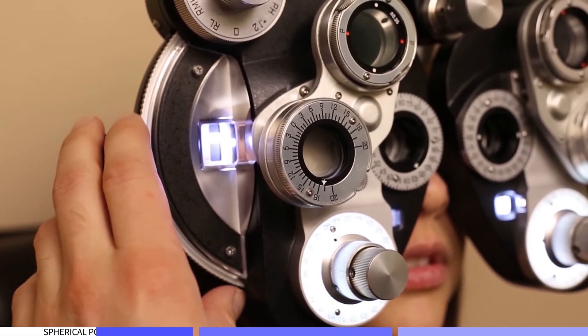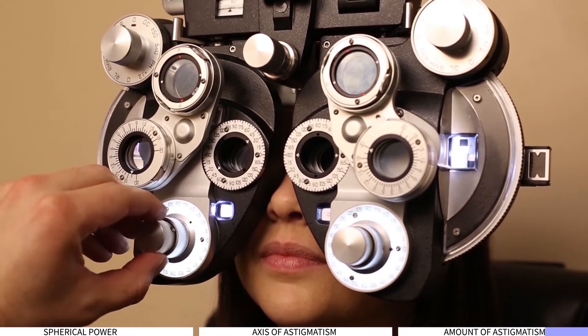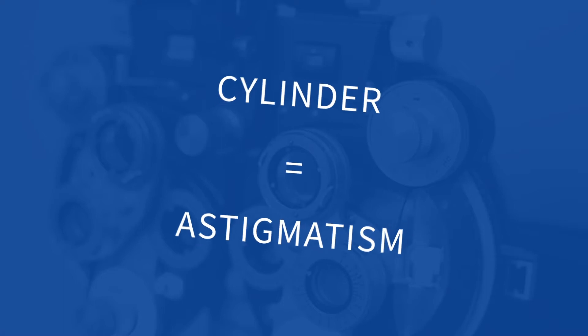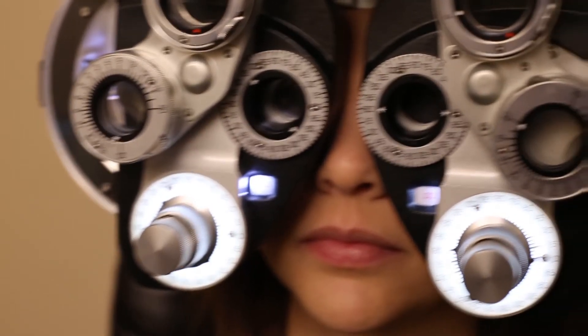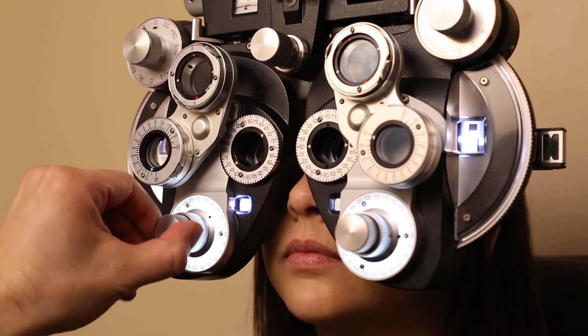Every glasses prescription has three parts to it. The first is the spherical power, which describes the amount of hyperopia or myopia. The second is the axis of astigmatism — the direction the astigmatism is oriented, between 1 and 180. And the last one is the amount of astigmatism, also called the cylindrical power, which describes how much astigmatism there is. These last two are in the category of cylinder. All of this correction is measured in diopters, and the units on the dials are always in quarter steps — quarters of a diopter.